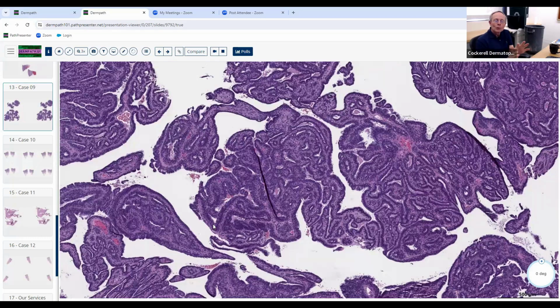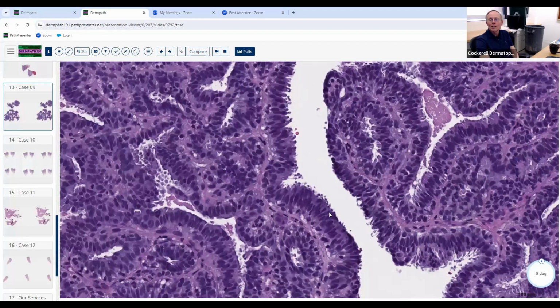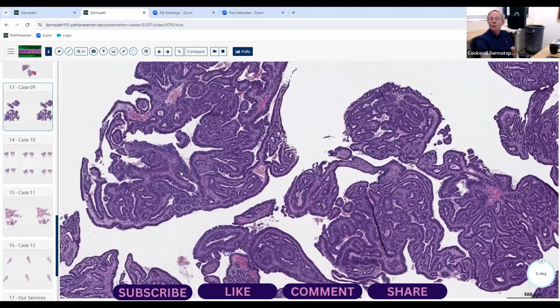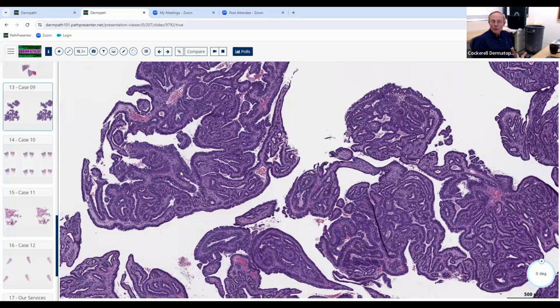So you don't really need to worry too much about how to distinguish those from one another when you're looking at the actual structure and differentiation of the epithelium. Once you see that it's papillated and it's apocrine, it's one of those two. And if it's a cyst-like lesion, often in the genital area, with a glistening red pyogenic granuloma-like surface and plasma cells in the center, then it's a classic example of Hidradenoma Papilliferum, and that's actually what this is. If it were on the surface of a warty lesion, often associated with nevus sebaceous, then it's Syringocystadenoma Papilliferum. So that's basically all you need to know about this lesion.